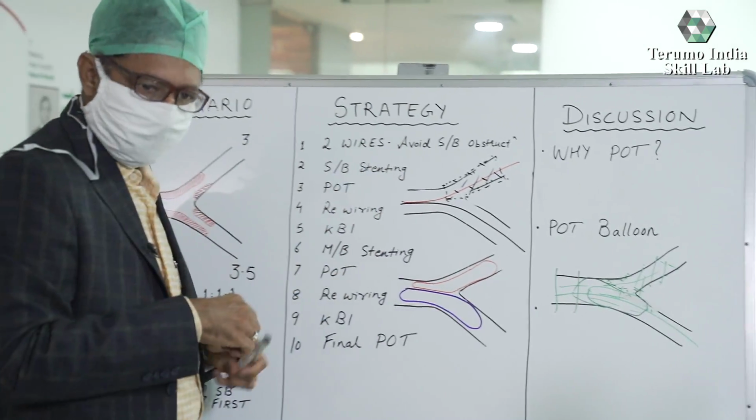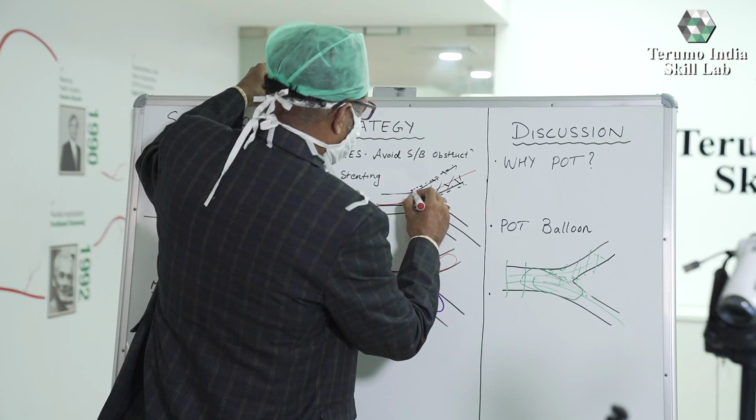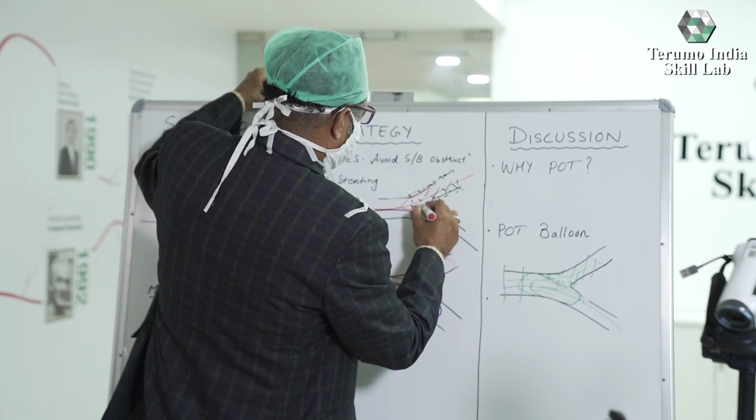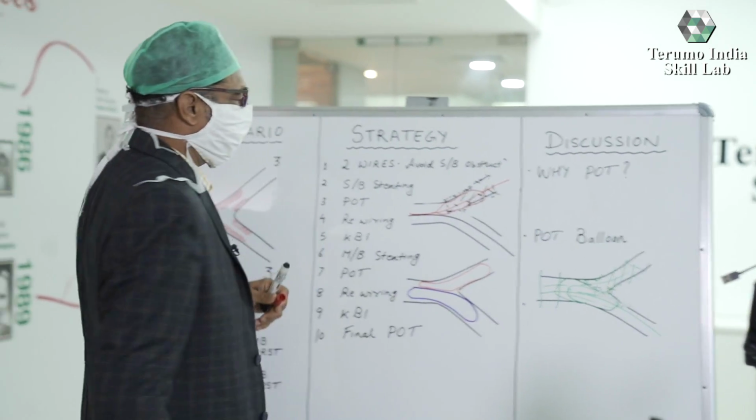After deploying the side branch stent, we optimized this side branch stent deployment with an NC balloon.